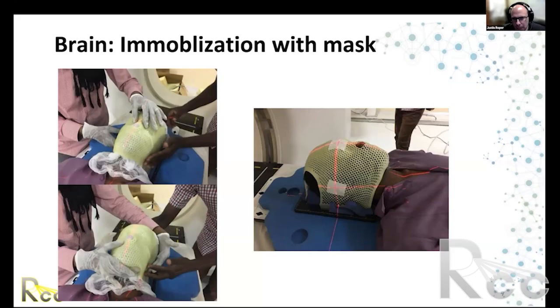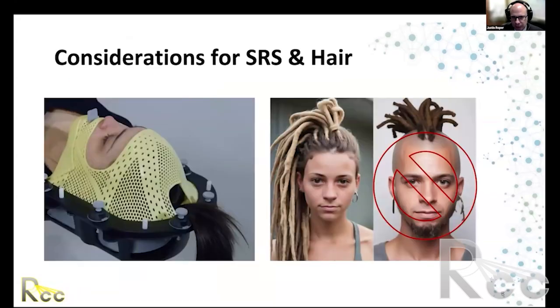Next slide, please. Justin, there's a question in the chat. I think the person was wondering when is it ever acceptable to use an open mask? That's such a great question. Let's go to the next slide, please, and I will show you an example.